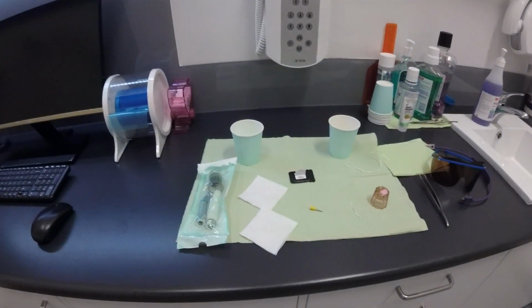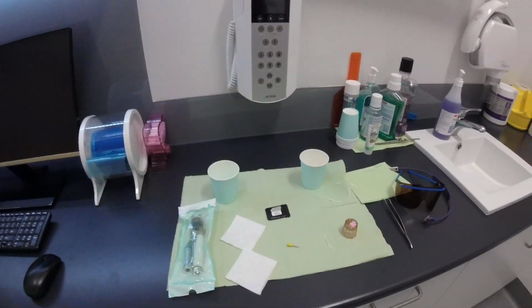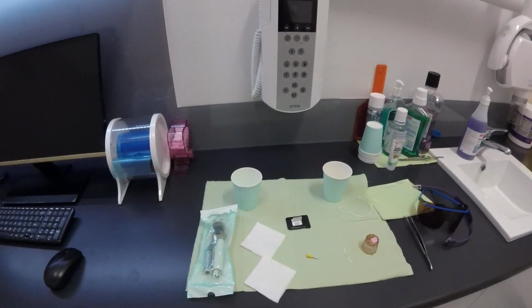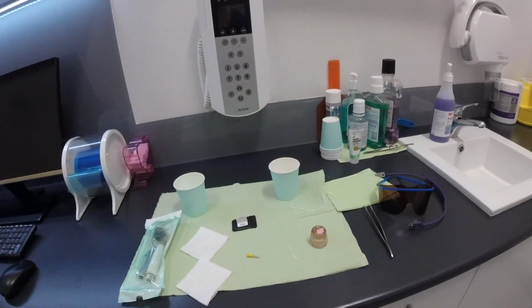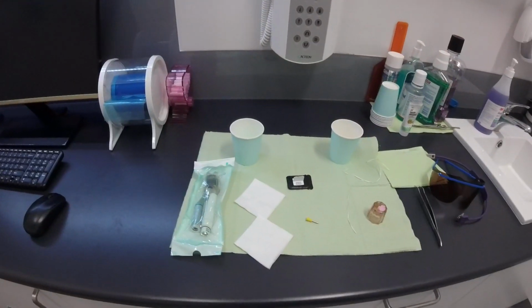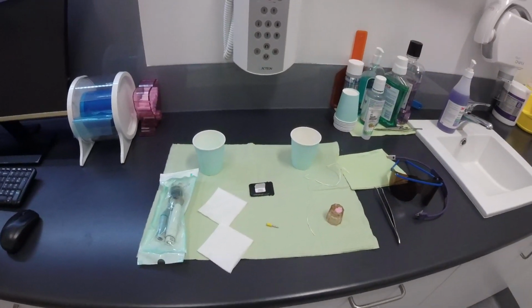So yeah, I hope that's helpful. We'll look at other setups, some other complicated ones. This is an easy one. Some other complicated ones, like setting up for a root canal procedure, can be a bit daunting when you're first starting. Or, you know, crown preparation, restorative, that kind of thing. We'll look at that more, but this is just a basic setup for your check and clean.